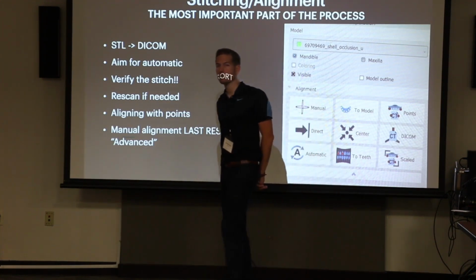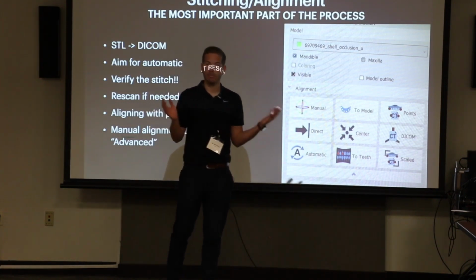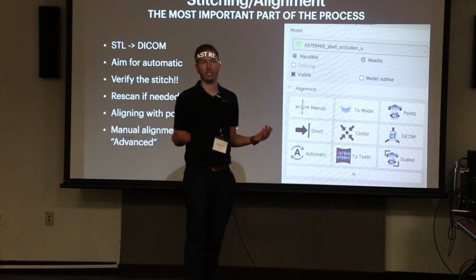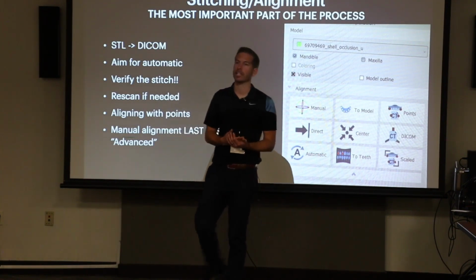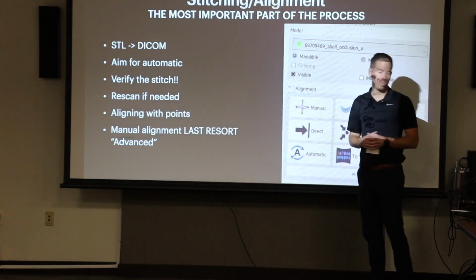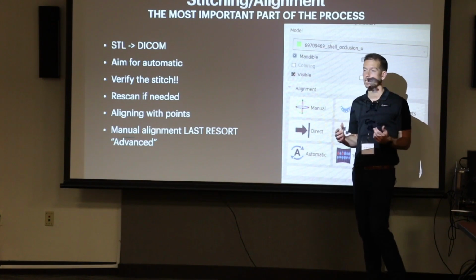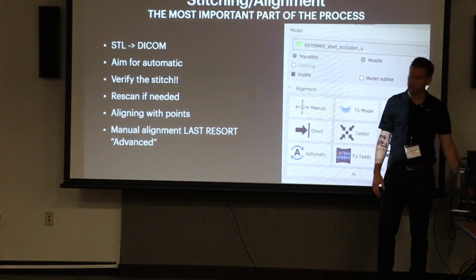Yep. So for your first cases, shoot for the predictable cases, avoid a ton of metal and a ton of zirconia. Identify that. Don't try to plan a guide on somebody, your first case, where there's zirconia everywhere. That's not a good first case, because you want it to be automatic. And when there's not a ton of zirconia and there's a lot of natural teeth in there, it'll automatically scan it and it'll work well.